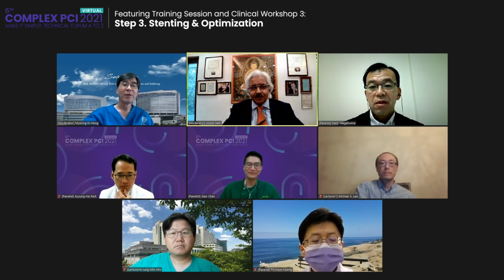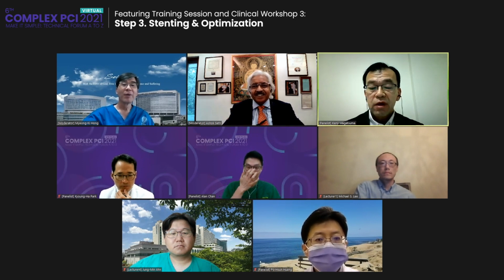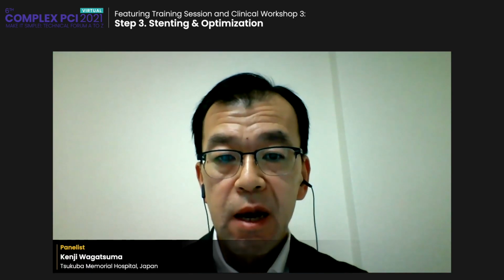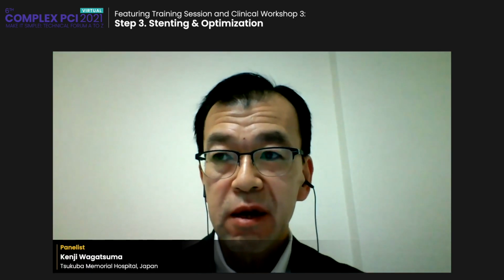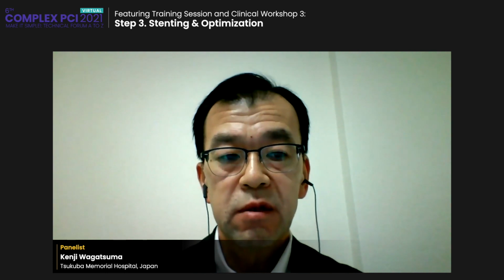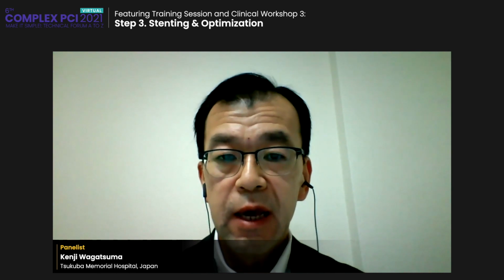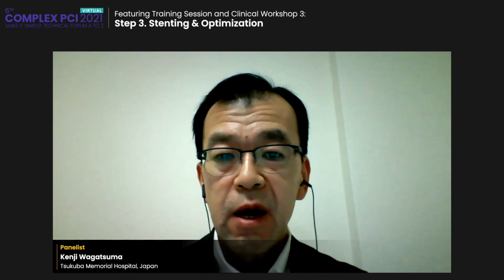Yes, yourself, the definition criteria as the criteria of choice for deciding between the two strategies. Actually, personally, I do not hesitate to perform complex stenting. I totally agree with the previous panelists. The difference between the DK crush study and the European bifurcation study is a quite different patient population.